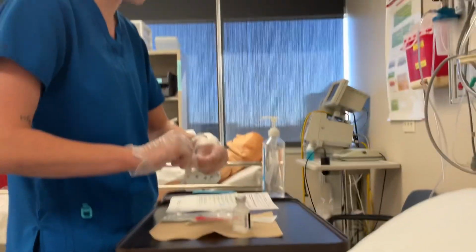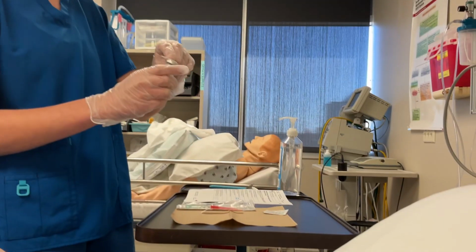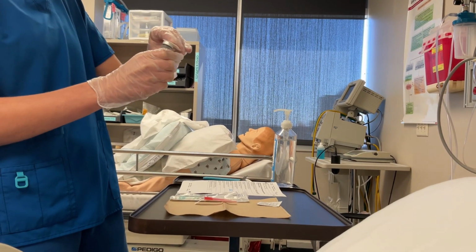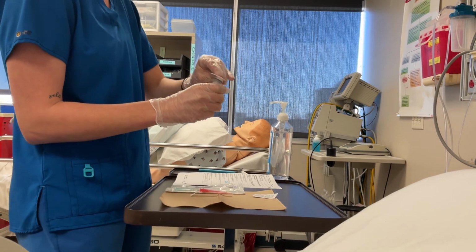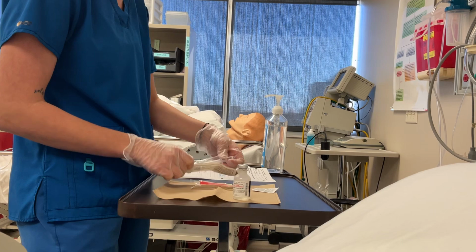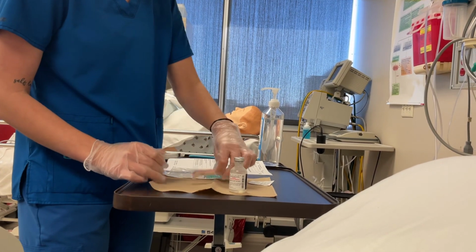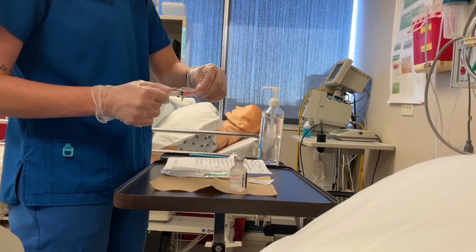So first I'm gonna pop my lid off and clean for 30 seconds in a circular motion. And then next, keeping it sterile, I'm just gonna take that off, put this on.